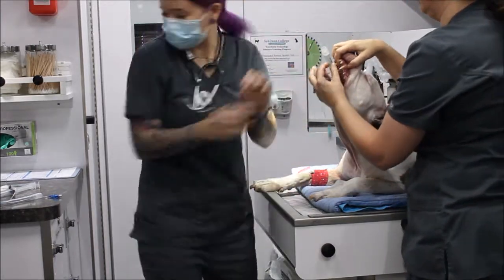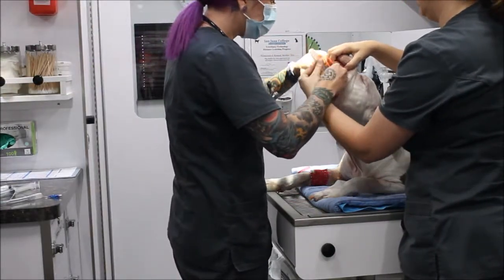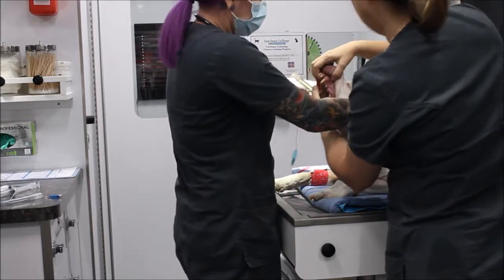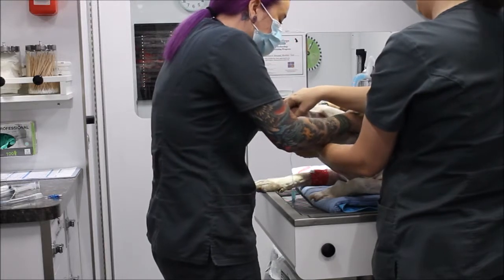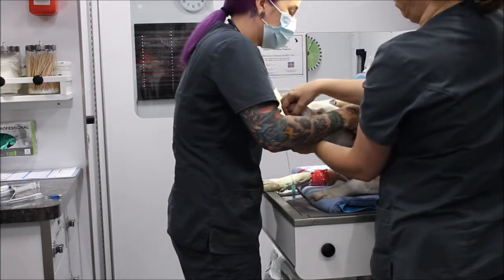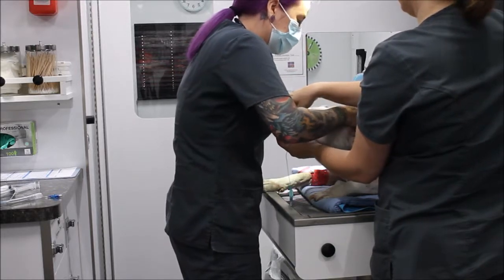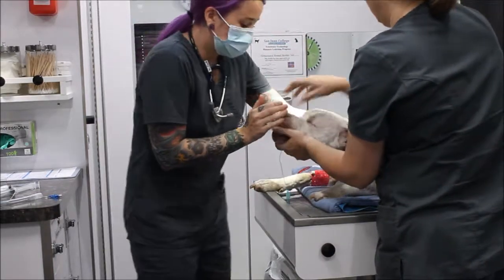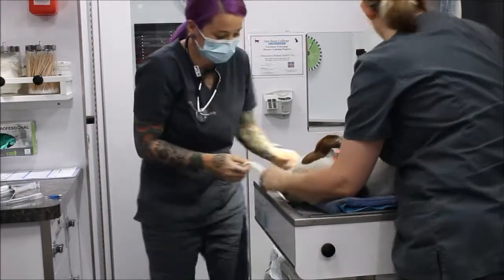I'm going to have her hold that while I get my tie. I can't feel a breath coming through the tube yet, so I'm going to tie that. Now I can feel a breath and I can see the tube is fogging up, which confirms that we have placed the tube correctly.